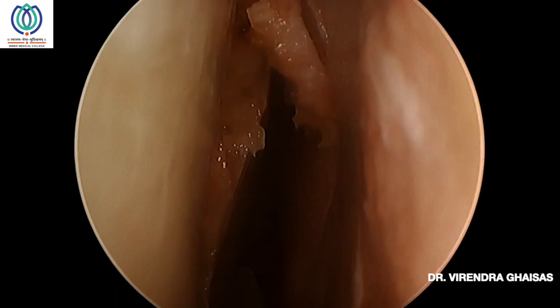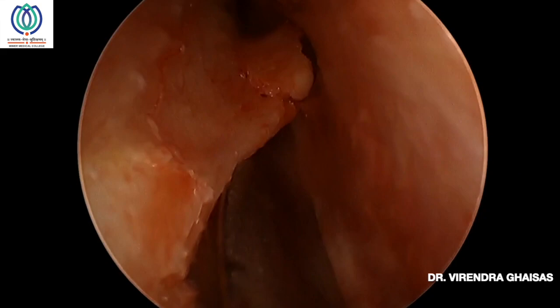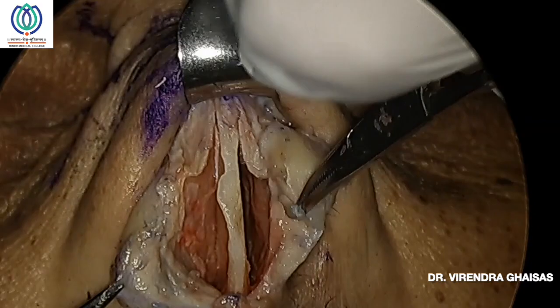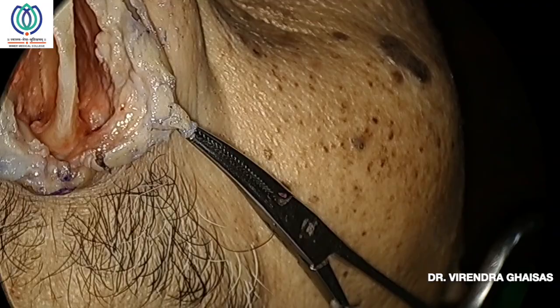Even then, if there is a small tear, you can neglect it or you can suture it later on according to the size of the tear. If the tear is on both sides, then you definitely have to suture it to avoid a septal perforation. So that's a bony cartilaginous junction. Keep 1 centimeter attachment of the bony cartilage superiorly, and inferiorly you detach it. And if there is a bony septal deviation, then you cut it with a double-edged scissor, and then with the Luc forceps you can remove this bony piece.